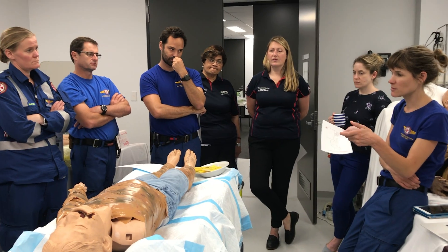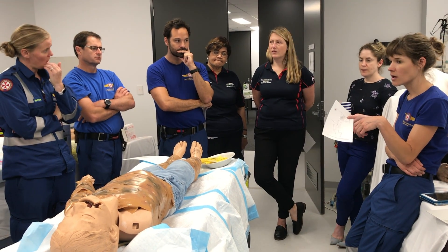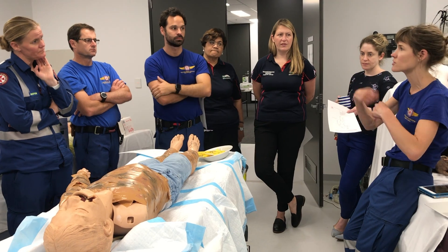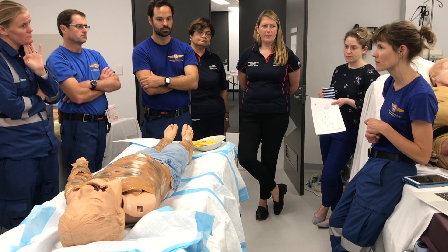Obviously there's going to be bleeding, and diathermy is available. Just some skin prep and then dress the wound. Thinking afterwards — don't put constrictive dressings around. You don't want to be wrapping cling wrap tightly around. No glad wrap.